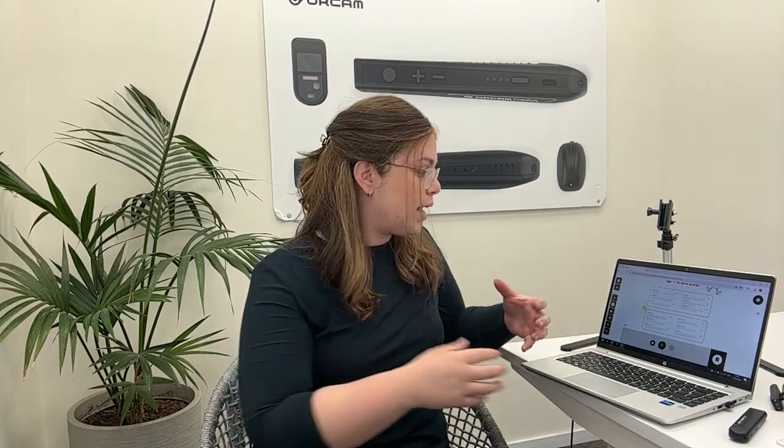Something else I want to point out about the smart magnifier, and while I don't have a menu in a different language at the moment, if you happen to come across one, the smart magnifier supports over 140 languages. So that's probably most of the languages in the world. You can have the system language in Spanish and read something in English, or have the system language in English and find a menu in Spanish, and it will translate it for you. You have access to so many things so easily, and it's so accessible. It just makes getting information and text so easy. So that's really cool. Just the menu itself is really cool.